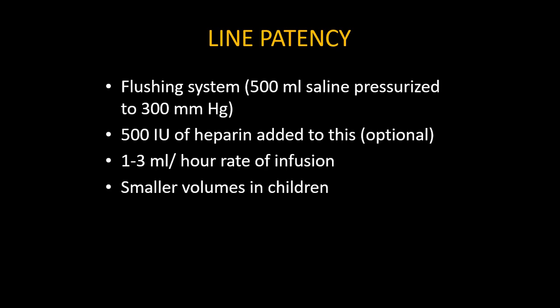Line patency, how the system maintains the line patency. There is a flushing system. Usually we use 500 saline. Nowadays, hardly anybody is using heparin in this. Earlier we were using heparin, but because of the high incidence of HIT, people have stopped using the heparin.